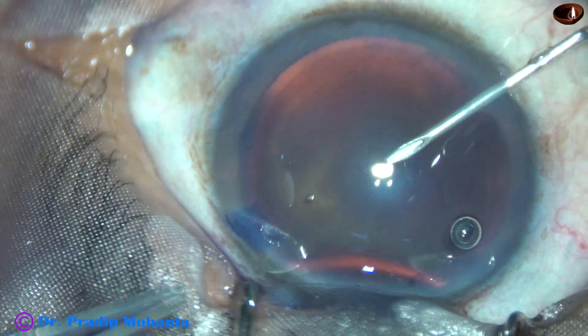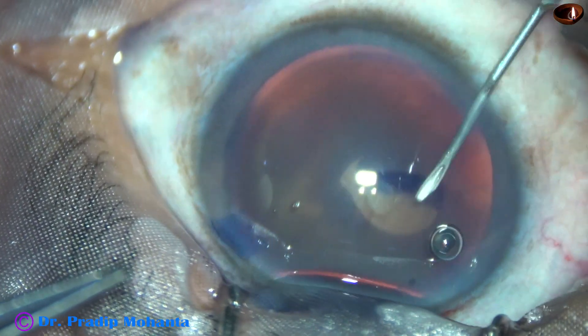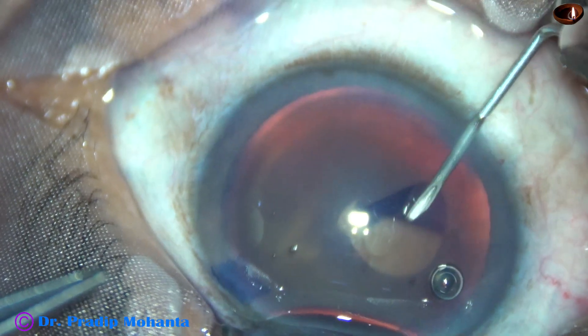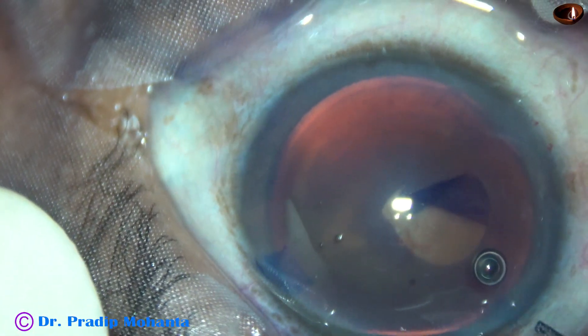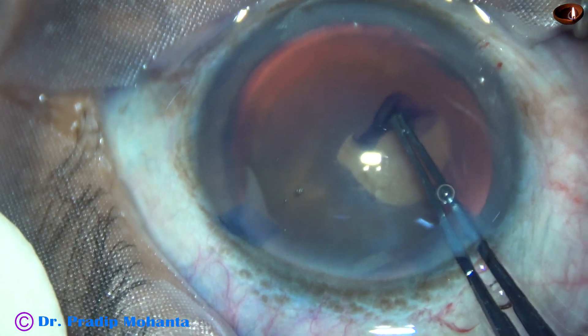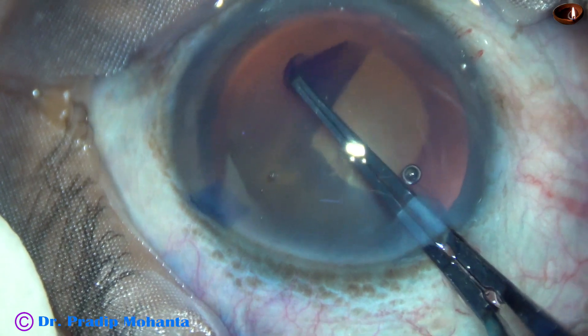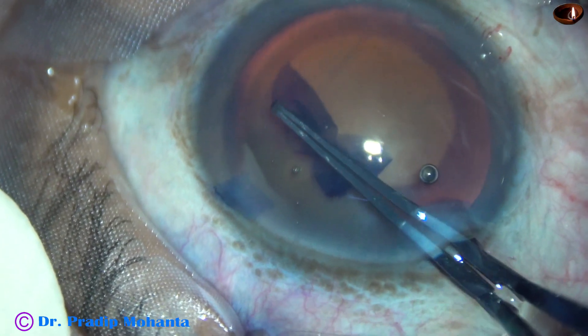In this case, I am raising a capsular tag with the needle and then using the utrata forceps. In deep-seated eyes, we have some difficulty in doing surgery from the head end.